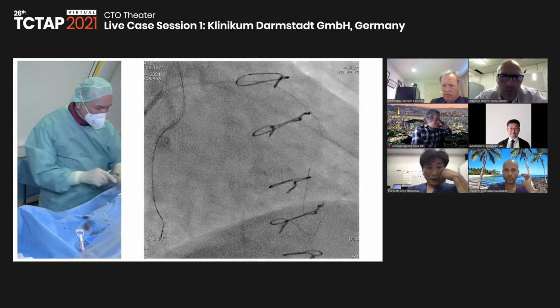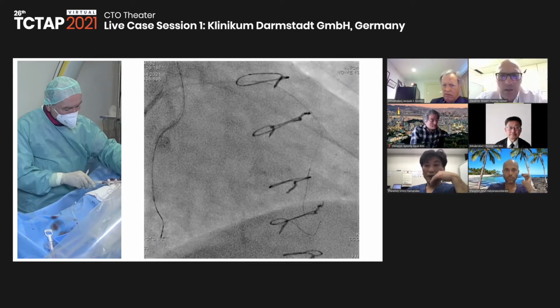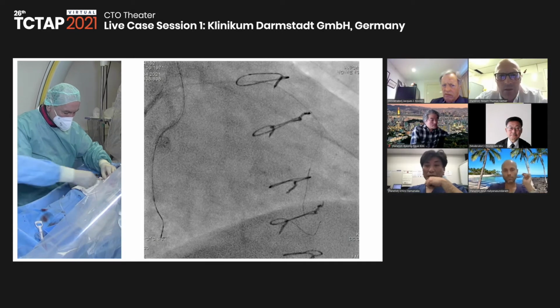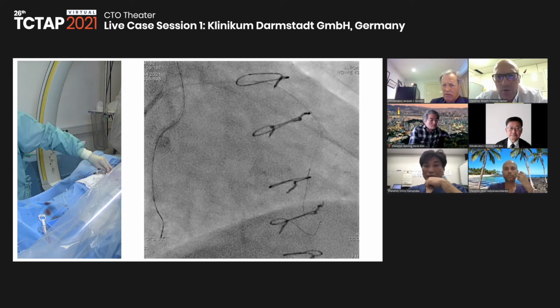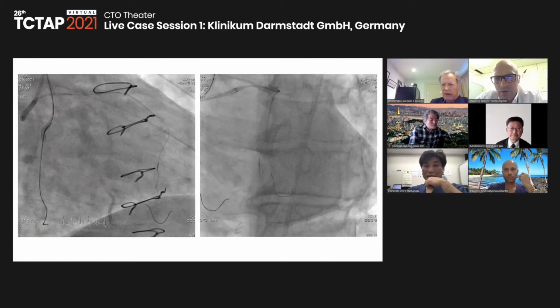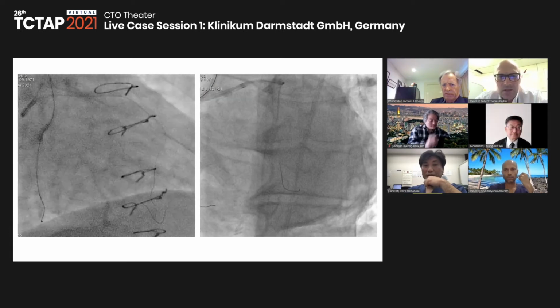We need to do an ACT here. I just wondered whether with the tip injection, you may be a bit too distal. If I have a look back at the tip injection, actually it's a bit more proximal than the distal part to the Caravel. Maybe you'll find some branching, connecting. I think it's a bit earlier.